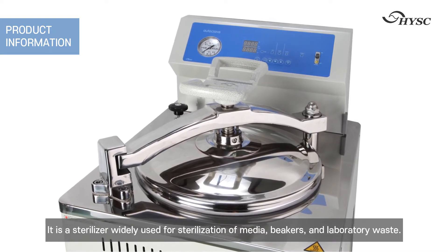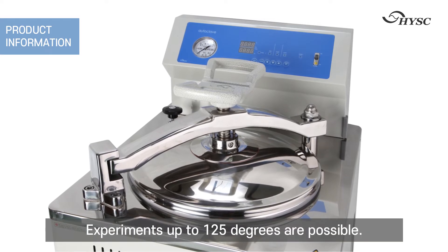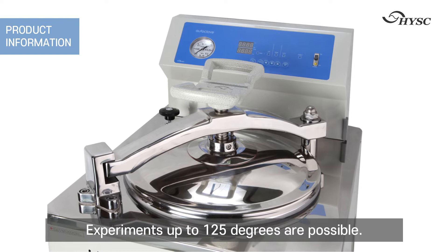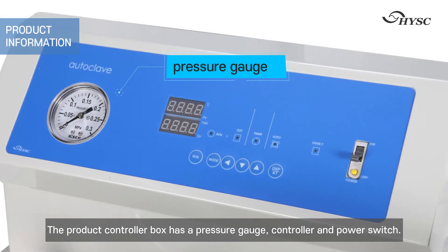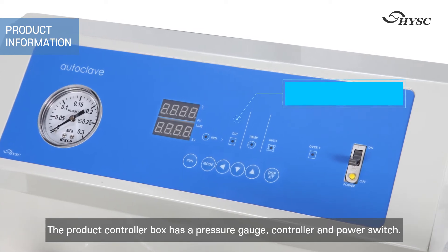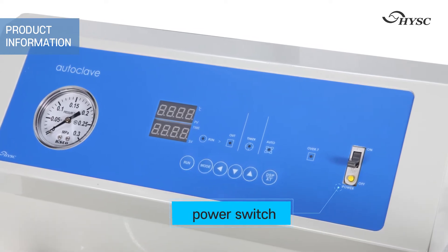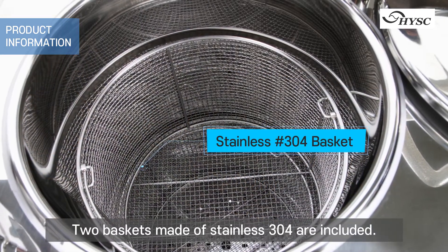It is used for sterilization of beakers and laboratory waste. Experiments up to 125 degrees are possible. The product controller box has a pressure gauge, controller, and power switch. Two baskets made of stainless 304 are included.